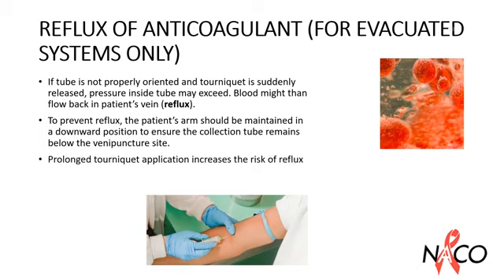Prolonged tourniquet application increases the risk of reflux. Reflux is of great concern when non sterile tubes are used because of the potential of transferring harmful microorganisms to patients' peripheral blood. Bacterial contamination is much more of a concern than reflux of additives, as the latter will be greatly diluted in the blood.